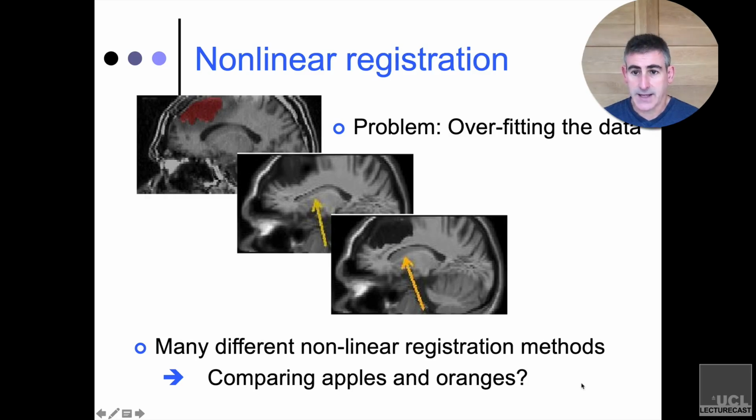In this case, you don't want to use nonlinear registration to, for instance, fit it to a normal template, because this person doesn't have a normal brain. You don't want to fill in the hole, like correct the shape problem, because the shape problem is probably what you're interested in, the fact that it is a patient with this kind of lesion. So you do need to be careful when you're using linear versus nonlinear image registration.